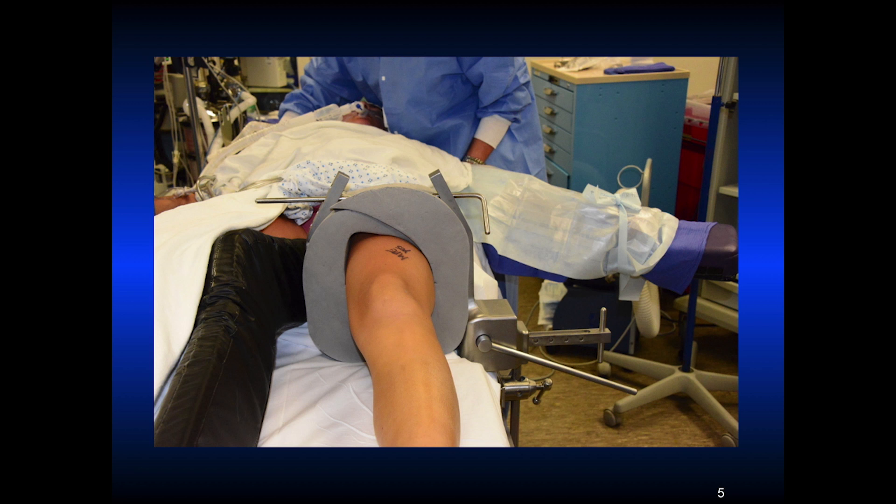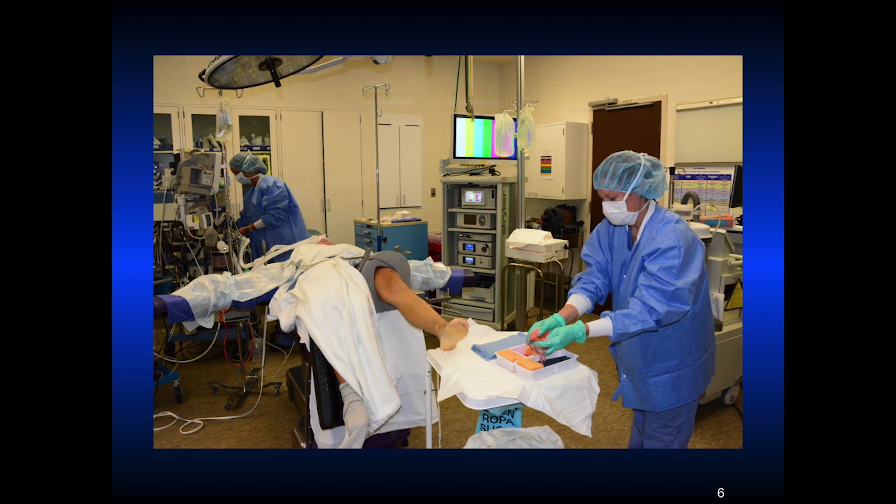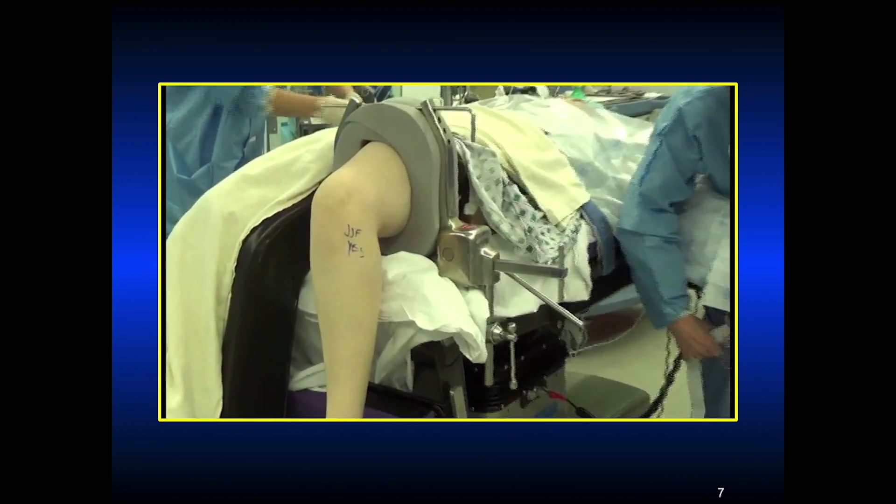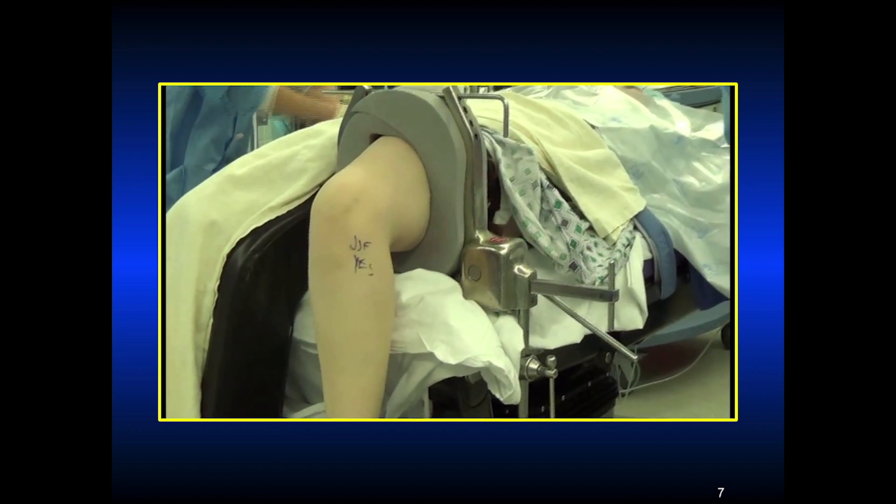Sometimes patients come in complaining of bruising around the leg holder. The well leg has a pad beneath the thigh all the way down to the foot, and then we drop the foot of the table to 90 degrees. This is the prep that's done. You've got to have that leg holder all the way down on the bottom of the table, and put your tourniquet up first, then put the leg holder on.